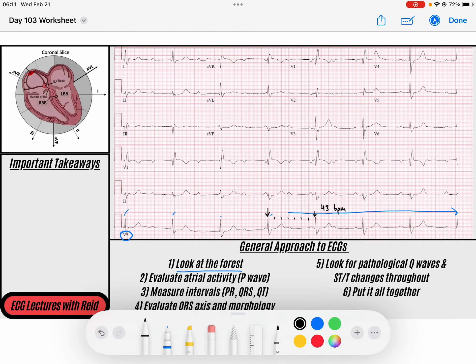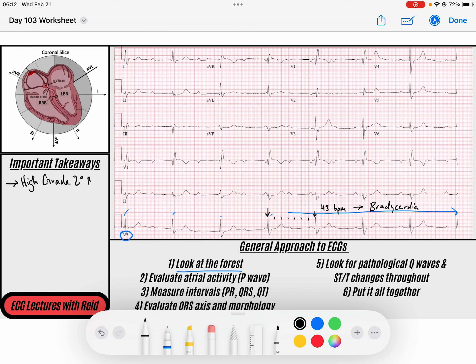We have a pretty significant bradycardia. When you see 43 beats per minute, I want you to think about something. This is not a 55 beats per minute bradycardia - 43 beats per minute is really not common for the SA node unless it is incredibly sick. So when you see bradycardia this severe, I want you to think of either a high-grade second degree block, where you have like two-to-one or three-to-one conduction.